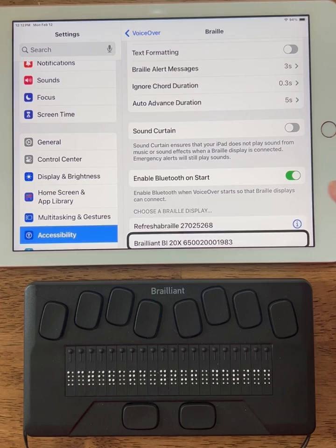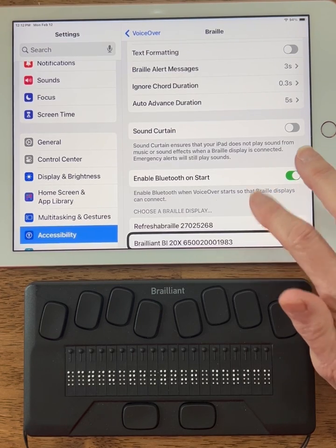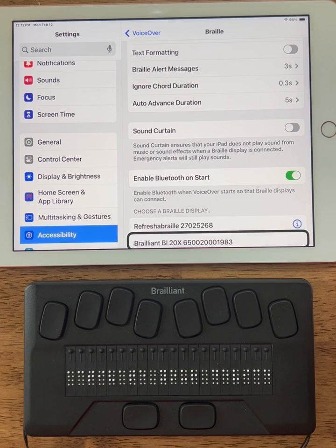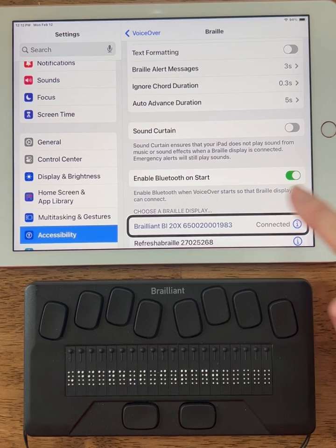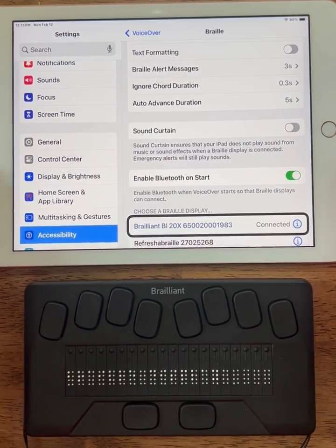I just paused VoiceOver from talking. It's now on the Brailliant BI 20X and I'm going to select that by double tapping. Now it says it's connected — I know it's connected on my Braille display and on my iPad.